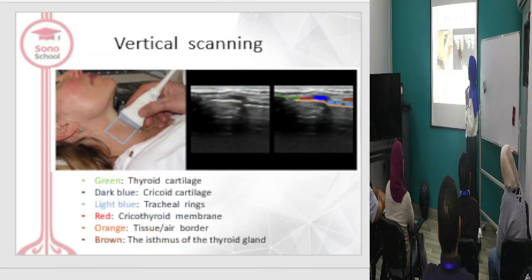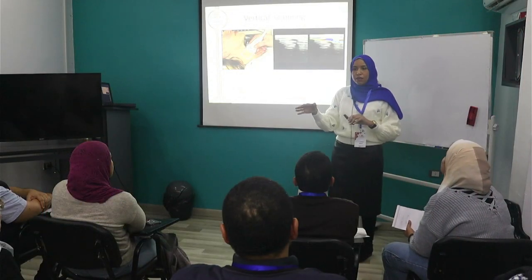cricoid cartilage, then a membrane, the cricothyroid membrane, then thyroid cartilage. This is our aim, demonstrating the cricothyroid membrane to insert a needle and save a life.